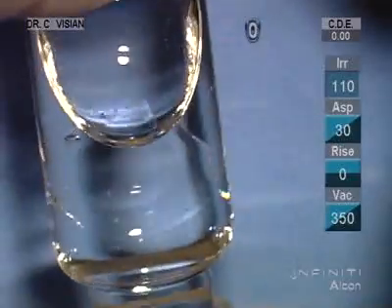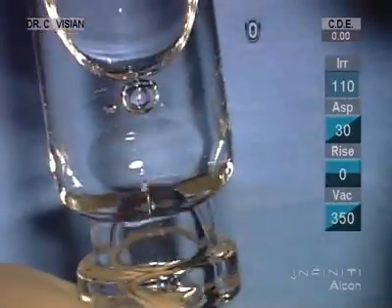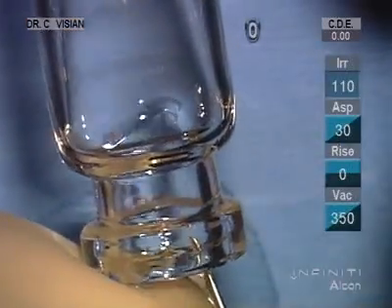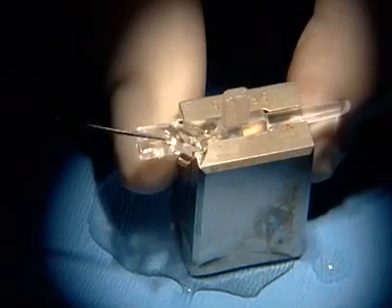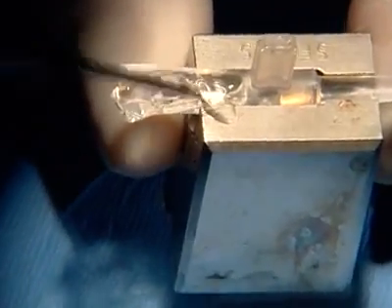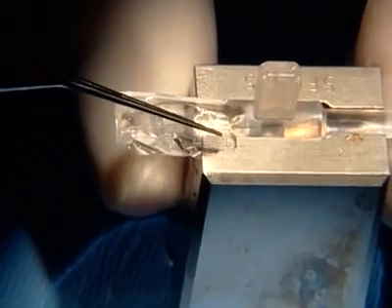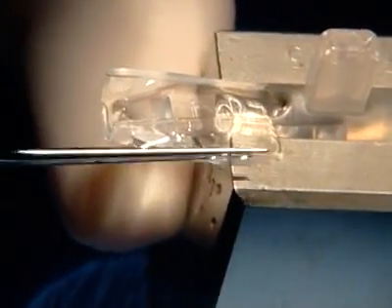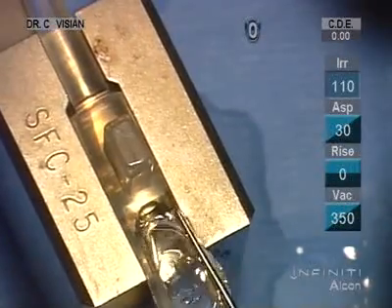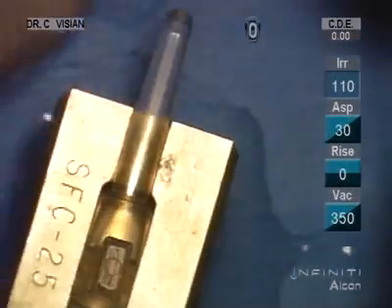Open our lens. We've confirmed the power and I like to sort of hold it upside down, let that lens float down. This is loaded in BSS and you can see the concave portion goes up on the side of the lens. We like to identify the little positioning dot on the leading right edge and trailing left edge, so we know the Visian is properly oriented, and we'll then place it in the little cartridge.